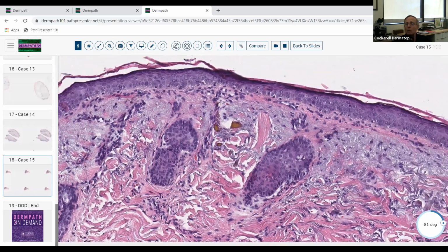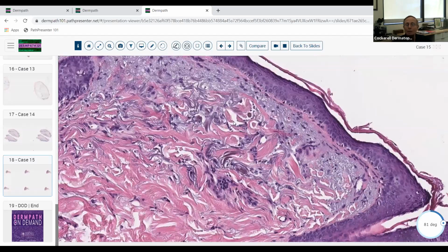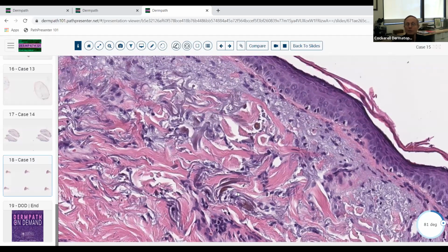So hopefully you all got that pretty straightforward. Here's another one over here, a little better banana-shaped structure. These aren't quite as well developed as the others yet, but they're all turning in that direction. And you all know I would recommend knowing the biochemistry of this issue. This basically creates this abnormal elastic tissue that becomes this acquired ochronotic pigment, usually due to application of hydroquinones.